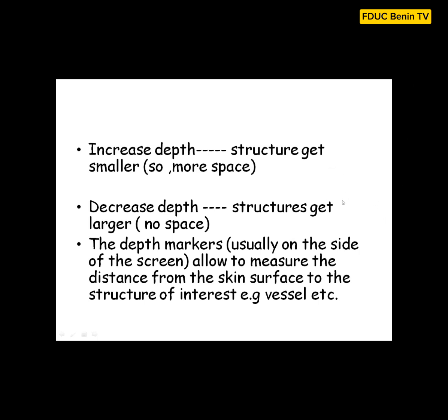With time, you find out that with these depth markers, you can also appreciate the distance of structures from the skin, from the surface. So you're able to say, oh, this structure is about 4 centimeters or millimeters from the skin. Because you can measure distances from the skin, these depth markers will help you to appreciate all that.